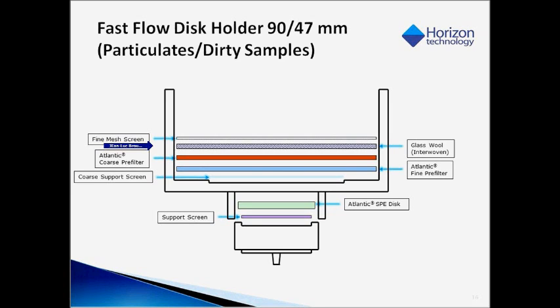Since the particulates are not discarded by an external filtering, the eluting solvent rinses the particulates together with the original sample bottle, hence ensuring that any analyte adsorbed on the particulate matter and on the inner wall of your empty bottle will be extracted along with the water sample.